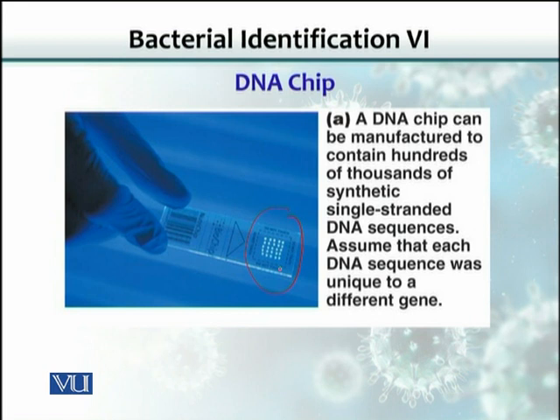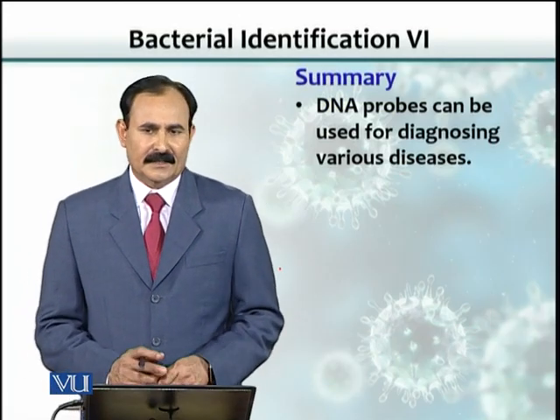The procedure is exactly the same. So it is basically DNA based. If the DNA fragment is there, our probe would bind to it. Otherwise, it won't bind. And when it binds, it would give us a color. And that color tells us that the interaction has occurred. We'll talk about PCR in a different video, in a different lecture.